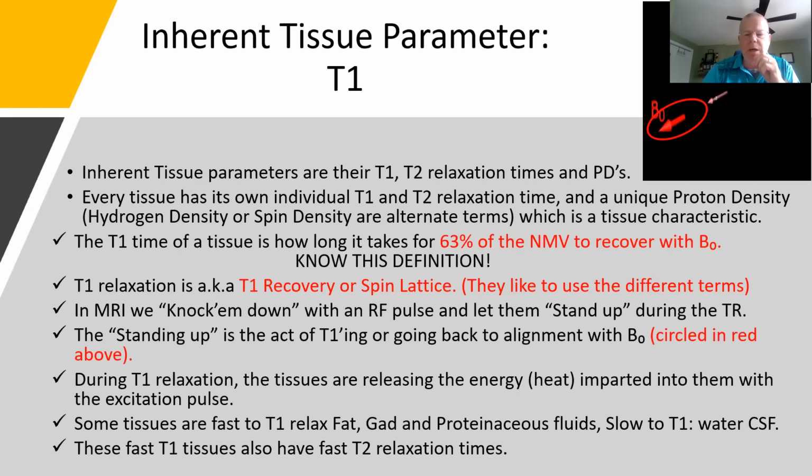Know that there are multiple tissues that we're going to be imaging, but for the most part, we're going to be imaging fat and water because in MRI, we follow the water. You've heard the expression follow the money. In MRI, we're following the water. The body's reaction to any kind of insult, be it infection, tumor, surgery, radiation therapy, is to force water to that area. So we're going to be imaging the water.